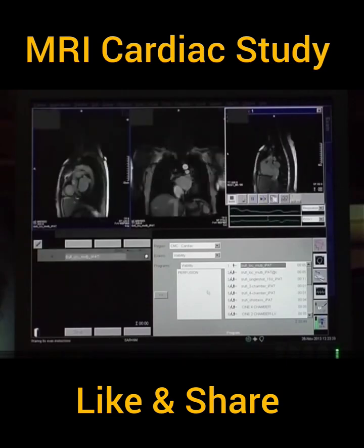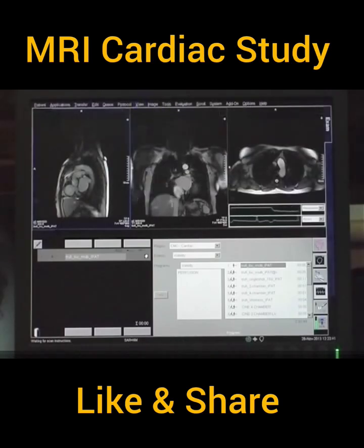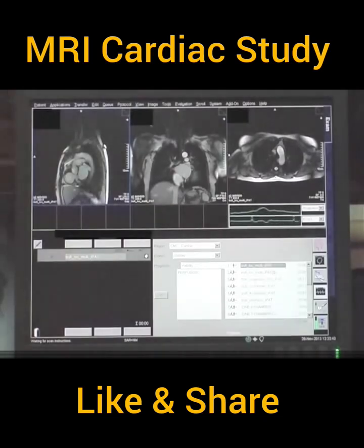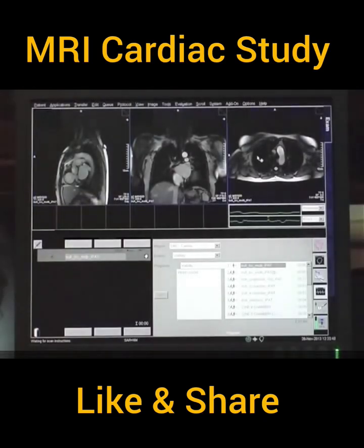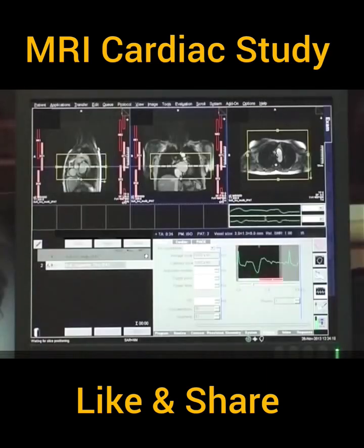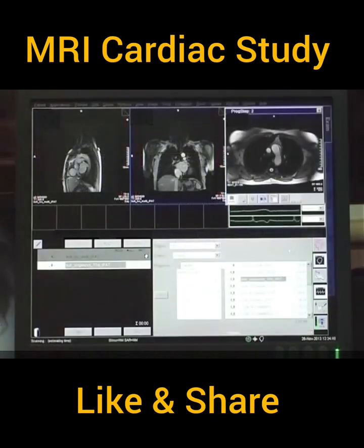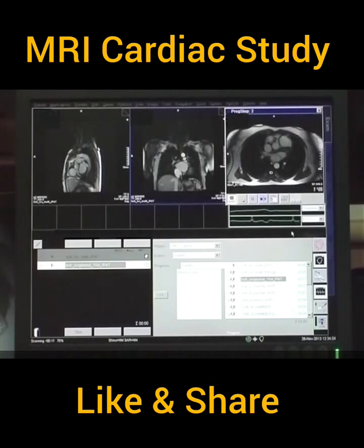Sagittal, coronal, and axial images are obtained using these 3 localizers, and SSFP true axial images are obtained through the thorax from the apex of the thorax to the diaphragm. This initial sequence is good for looking at the mediastinal structures, the heart, vascular structures, and the lung fields.